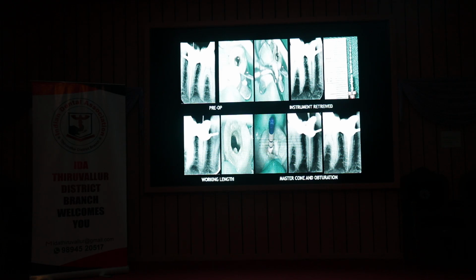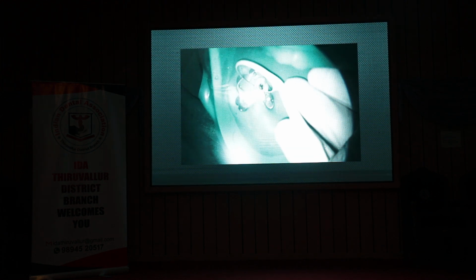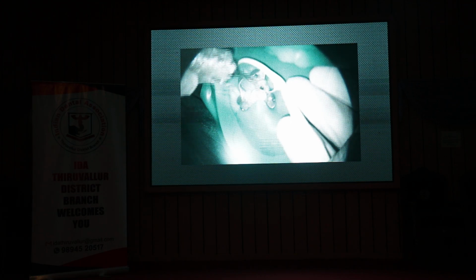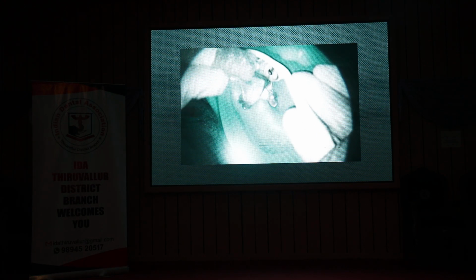Another one, lower premolar, full length of the root canal, she has broken the instrument. I'll just show you the video now. That's the case, of course. We'll just see whether I can play the video. I'm just using an ultrasonic ET40 tip. You'll have to watch carefully.